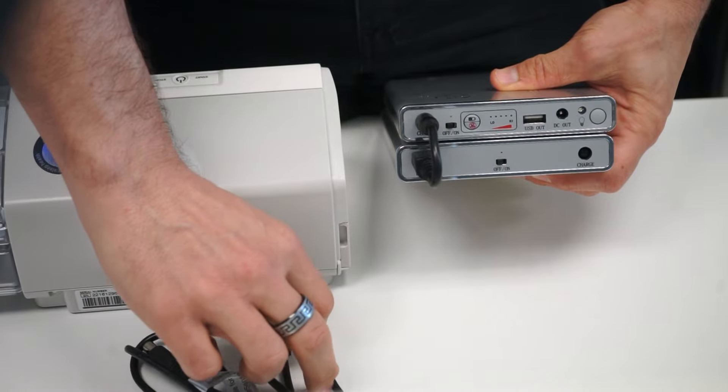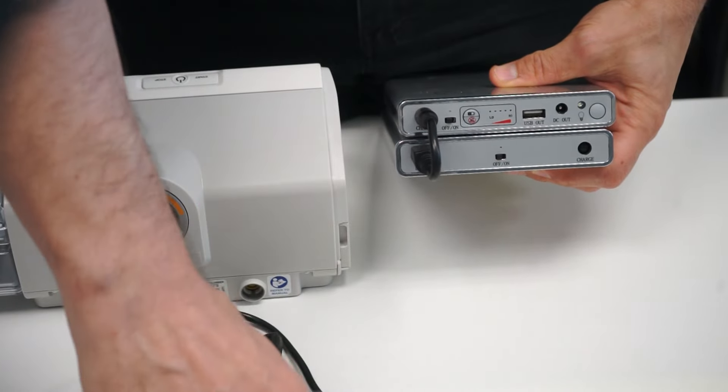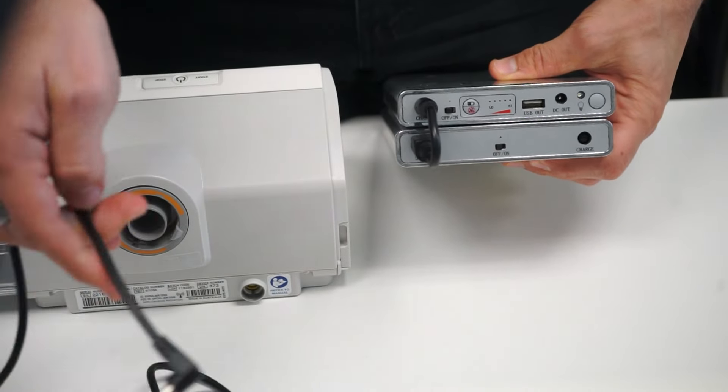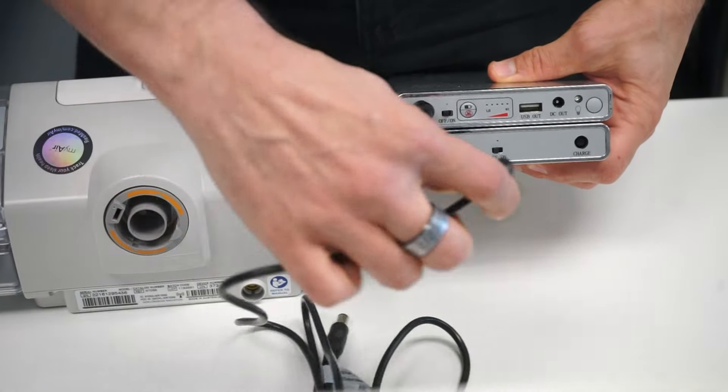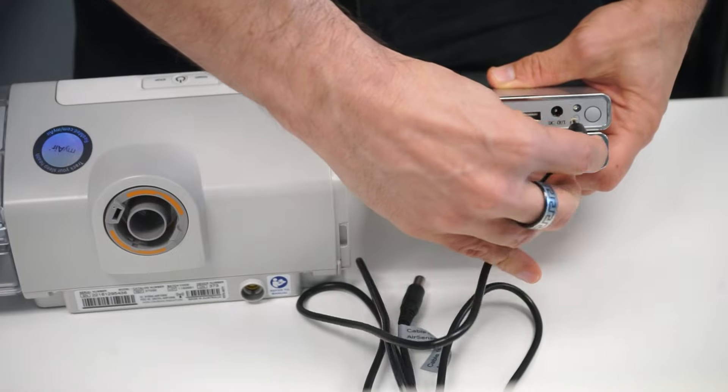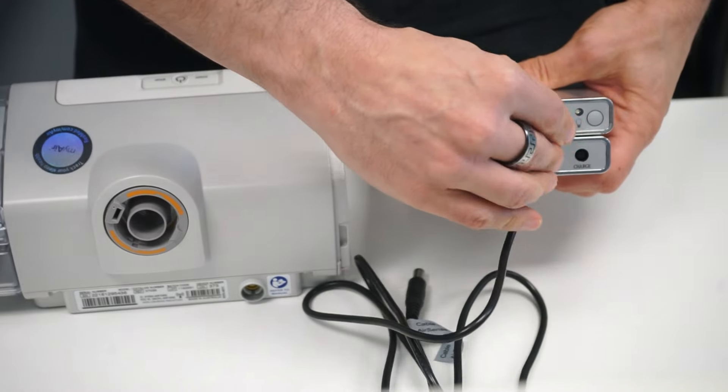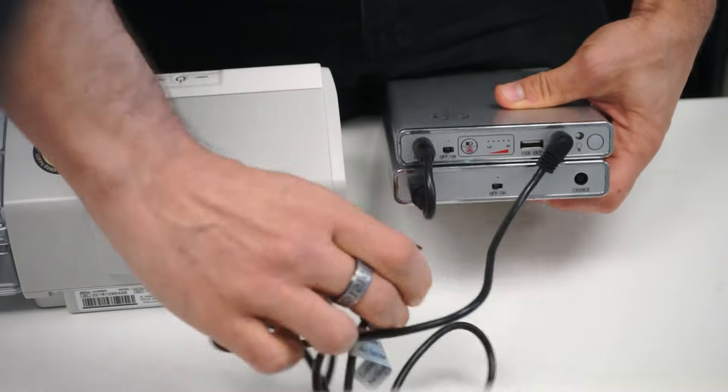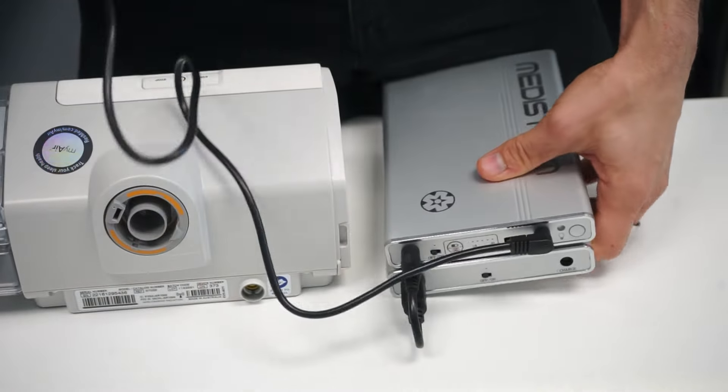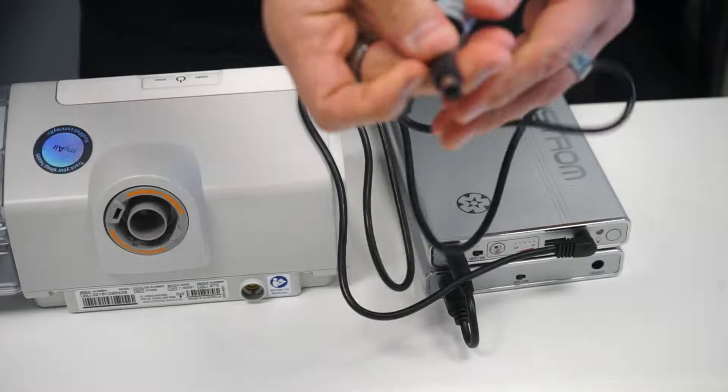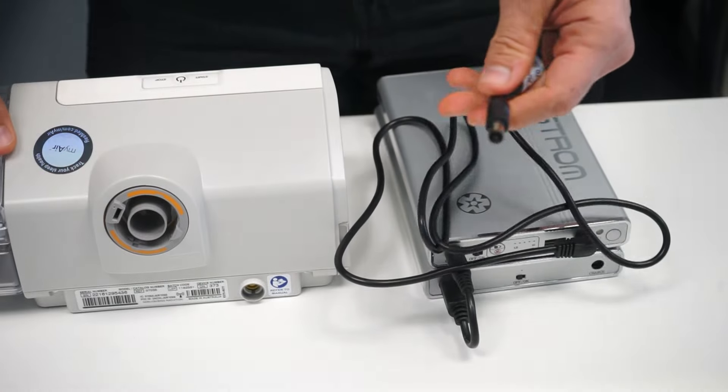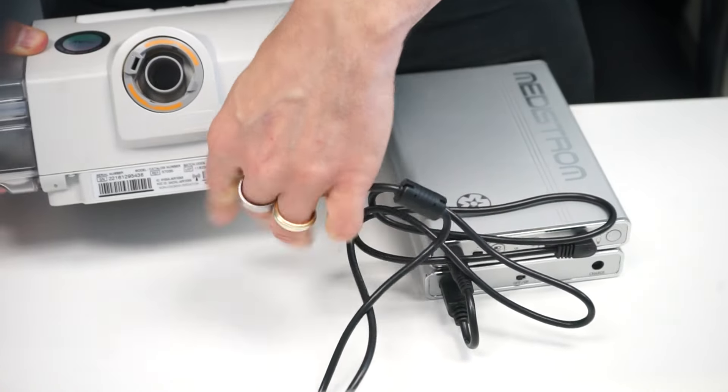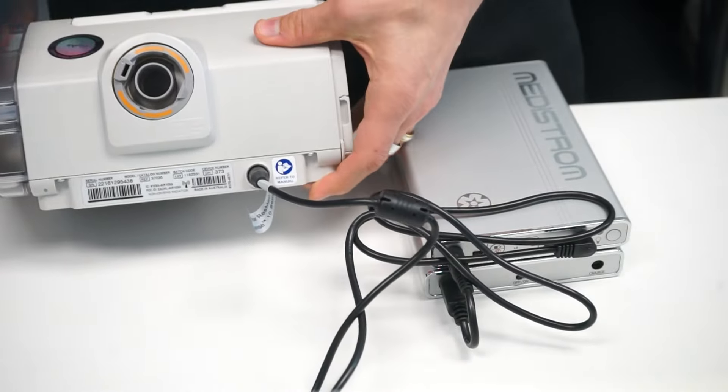From there, you're going to take the power cord that is intended for the AirSense 10 and plug it into the DC out. You're then going to take the remainder of this cord and plug it into the back of the AirSense 10.